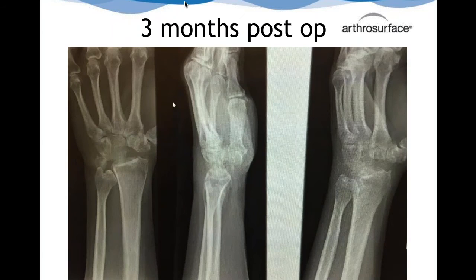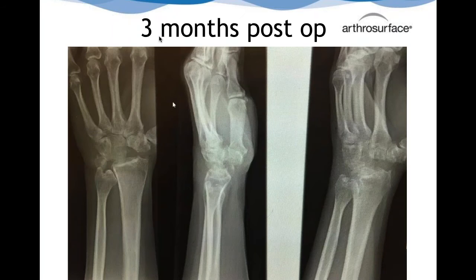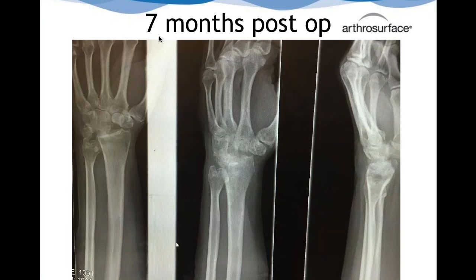But I started to notice that something was a little bit unusual. If you look at the x-ray on the left, where the capitate sits in the lunate fossa, you can see that there's a little less space between the bones. If I go back to the previous one, you can easily delineate the capitate and the lunate, wearing out a little bit more. And then basically within 9 months, she was basically bone on bone. And this is also another problem with the proximal carpectomy, in that the shape of the capitate, again, does not fit into the lunate fossa very well.